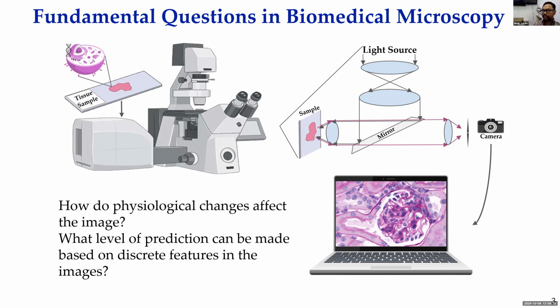I would start with a bit of a fundamental question that our lab in biomedical microscopy or biomedical medicine is trying to understand, which is the basics of many labs. Even in the clinical domain, when you are looking at a slide, it is quite apparent that an image is worth 1,000 words, as you can see. In a computer, that comes through various processes like tissue section preparation on a glass slide. It goes through microscope optics, preparation of the tissue, imaging.